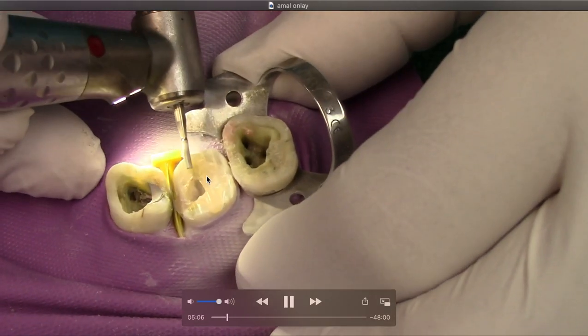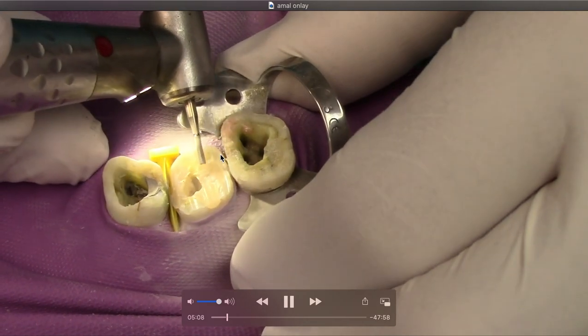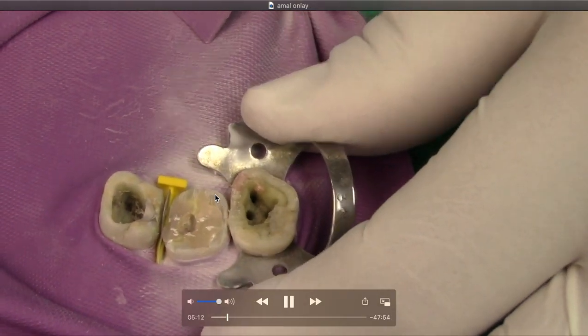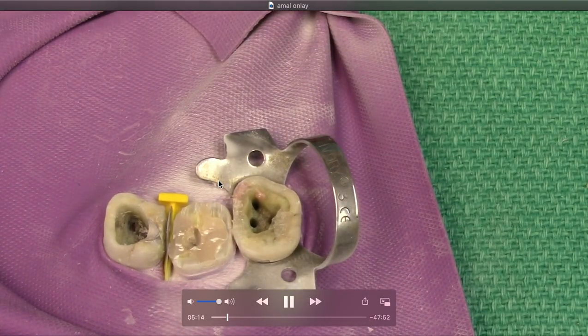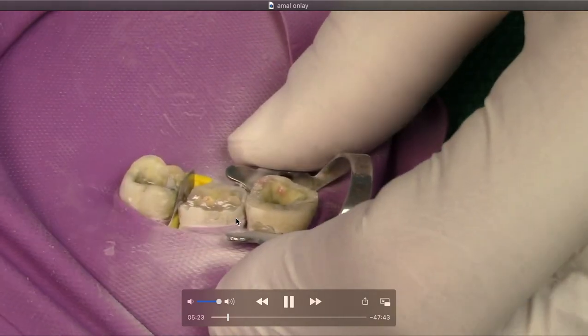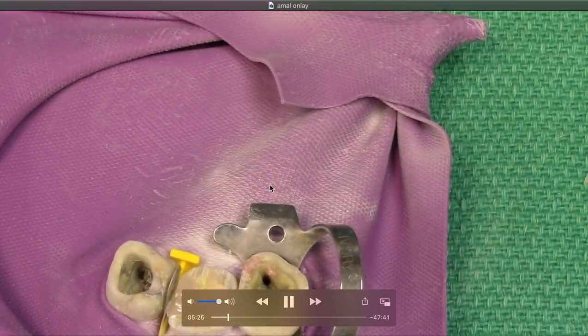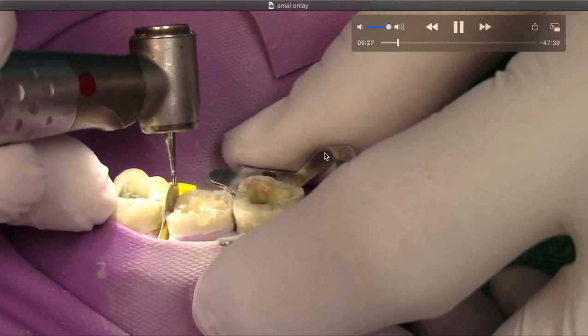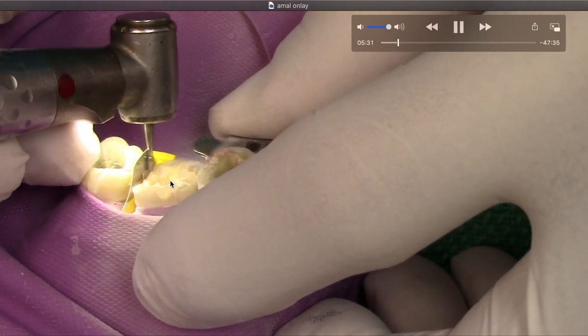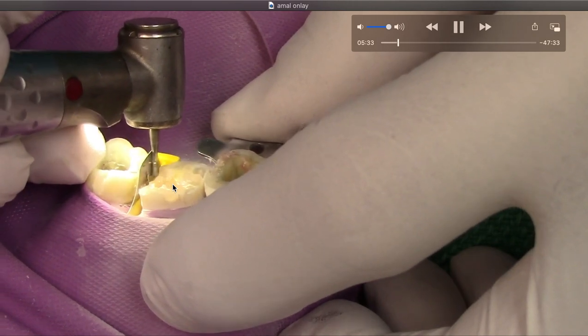Now we're going to join the dots. Don't take one of those flat diamonds that looks like a pancake and make a perfectly flat table, because you won't have any resistance form when you're carving your amalgam. There is some composite here — I'm going to pretend it's just tooth structure. Every clinical situation is different whether or not you would remove all of it. Ideally you would, but in this case we're going to pretend it's just natural tooth structure. There's the beauty of the fender wedge.